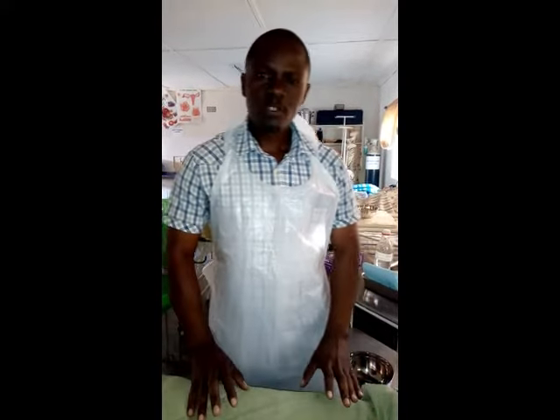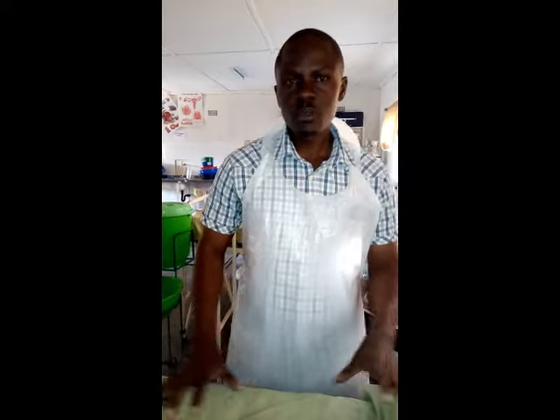As for today, I want to present on nasogastric tube insertion. So nasogastric tube insertion, for the beginners who are just starting foundation in nursing, they have to learn about the tubes that we insert in the patient.